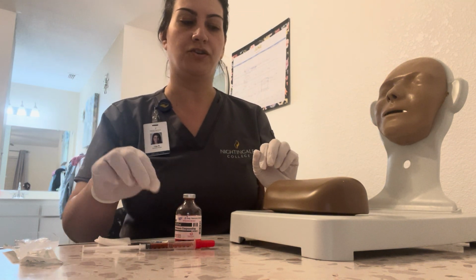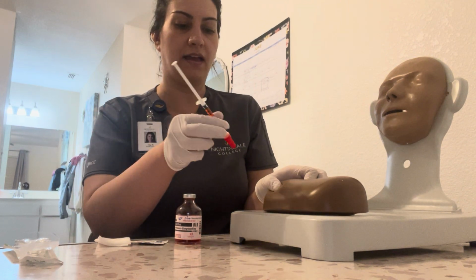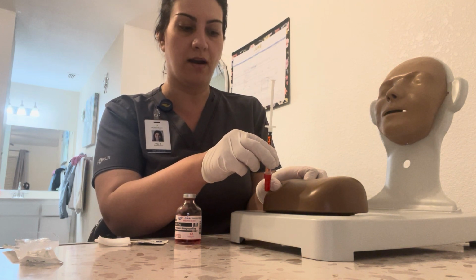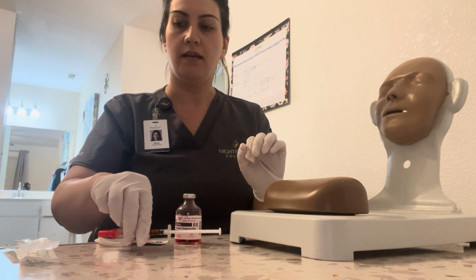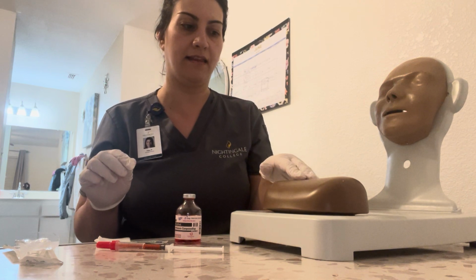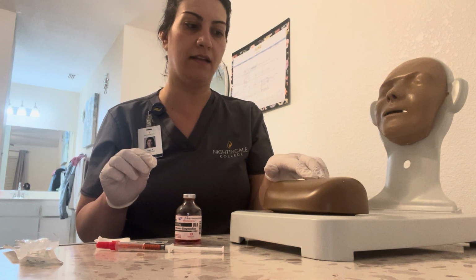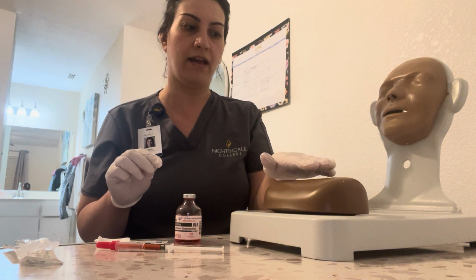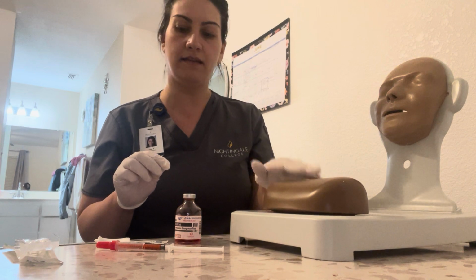Next, we want to measure. We're going to pinch the skin here and measure that our needle size, starting from the top fold to the bottom fold, is half the size of the needle, which it is. And we want to go ahead and assess the site, that there's no infection, no bruising, no swelling. And also we want to palpate to make sure that there's no edema or any tenderness, which there isn't.